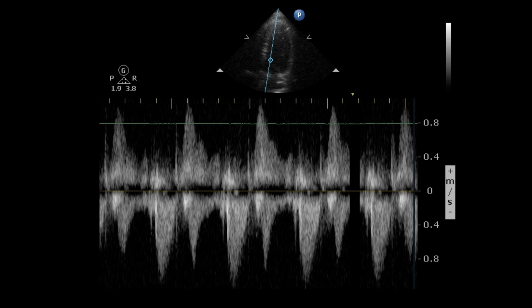And so there is a special form of Doppler called continuous wave Doppler that is less sensitive to the velocity, the ultimate velocity, that we can actually utilize. And what it does is it basically dedicates some of the crystals to constantly talking and some of the crystals to constantly listening in that ultrasound head. And so it'll give you a velocity, but it won't give you a precise location for where that velocity is taking place. We don't have the location precision along that line as much as we would with a pulse wave, but we can tell you that it is a higher velocity somewhere along that line. So that is the whole idea of aliasing and a little bit of a ways to get around it.